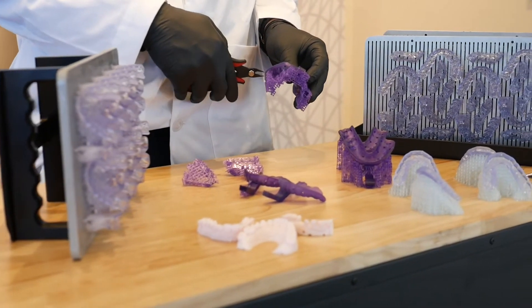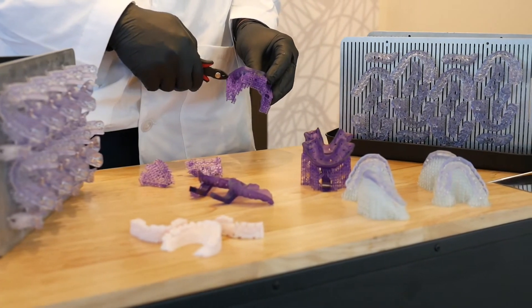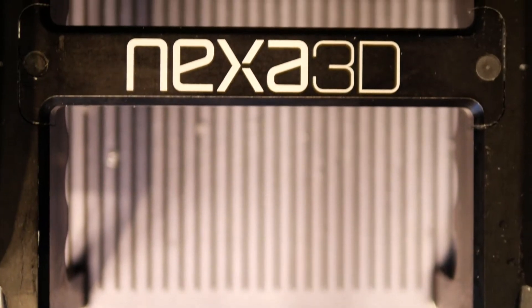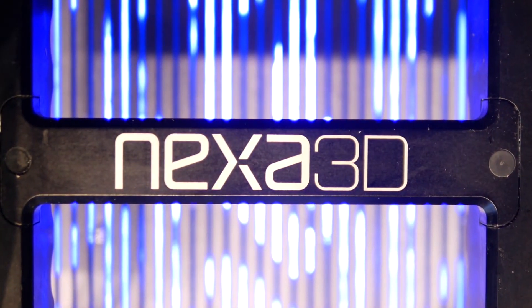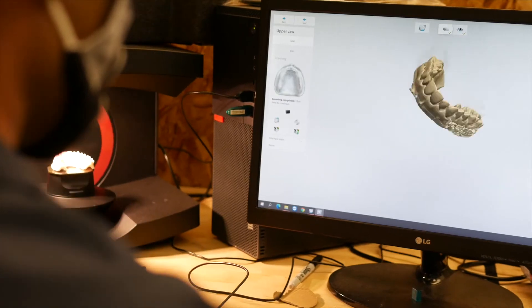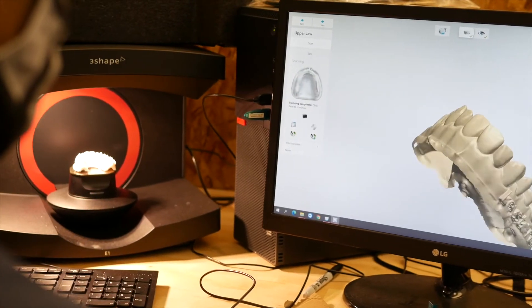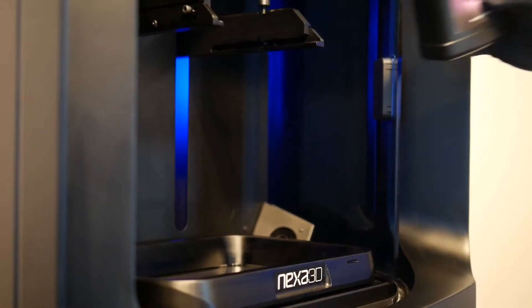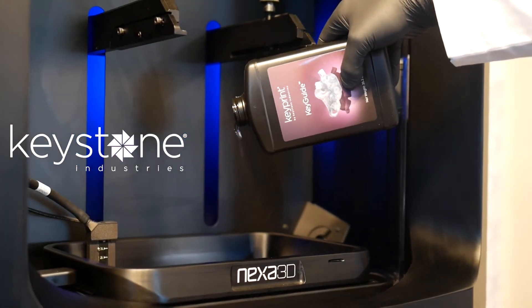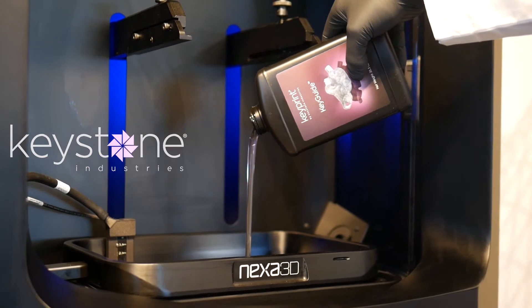The NXT 200 dental printer uses Nexa 3D's proprietary LSPC technology. The 4K resolution is provided on a build platform larger than those found on DLP printers. The Everlast membrane ensures fast, low-force layer separation and consistent performance from the first to the last print.